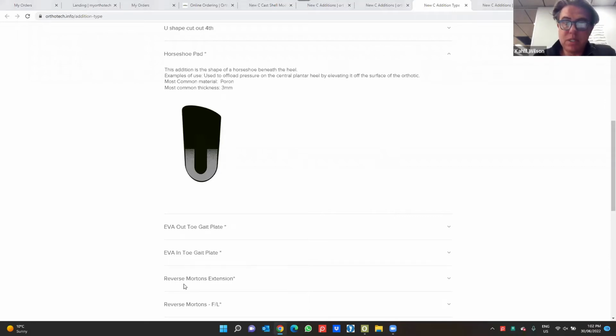hang on, I've got a question here that I've missed, hold on. I've been caught out recently when I wanted an intrinsic met dome. Sorry, this question's obviously been sitting here for a little while, so my apologies. But the lab notes weren't read until after 3D printing, so it had to be an add-on. How to make sure the notes are read before the shell is made.